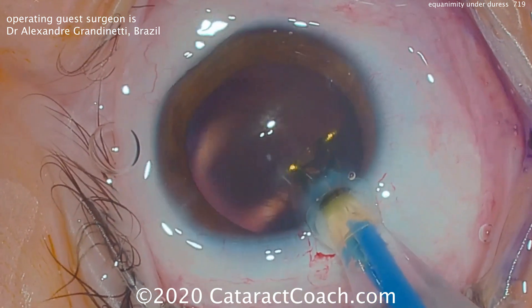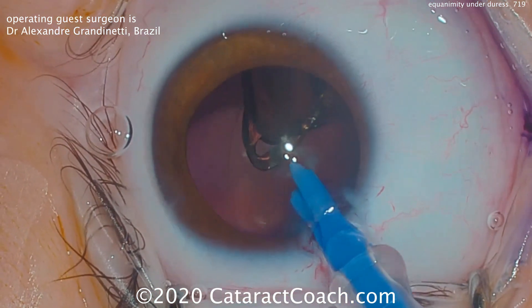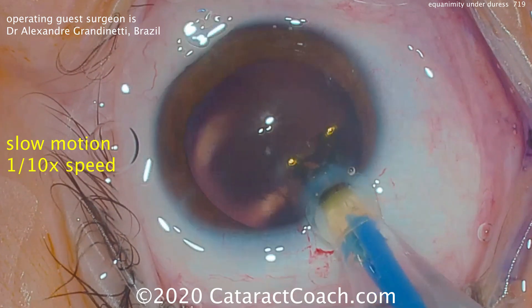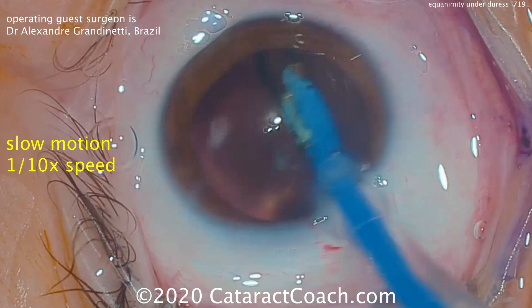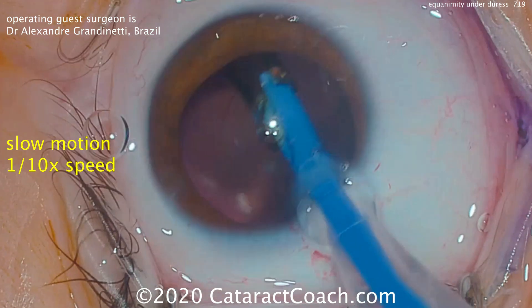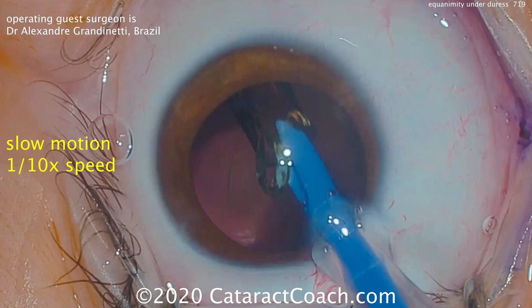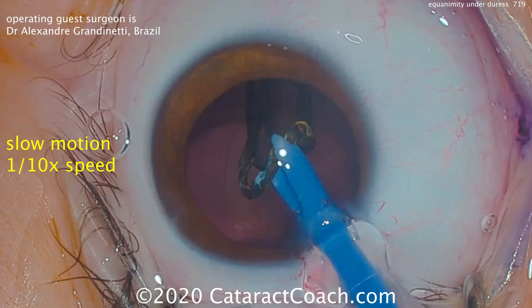The lens is delivered and pushing a little more — oh wow, what happened? Watch again at one-tenth normal speed. Due to lack of proper lubrication in the injector, it shoots out very forcefully, and the IOL just punctured the posterior capsule.